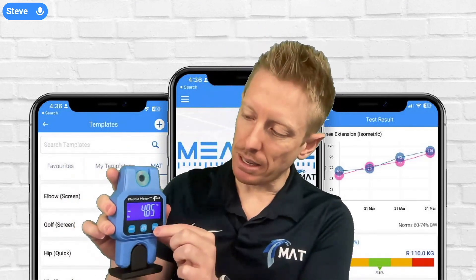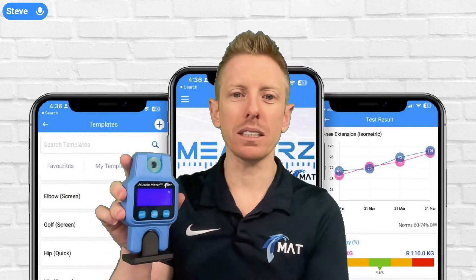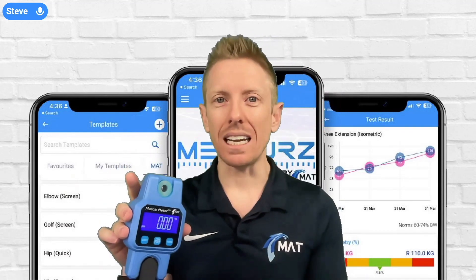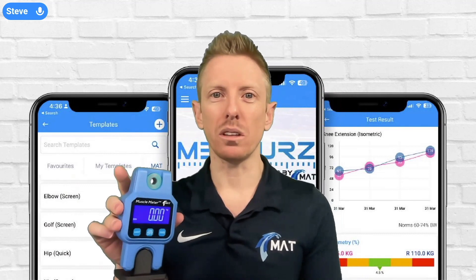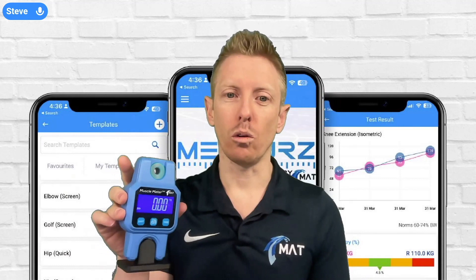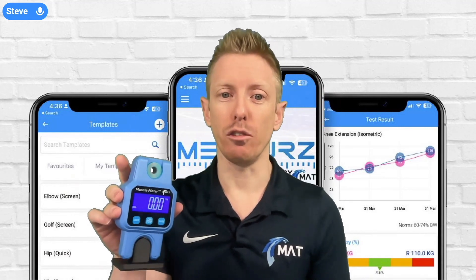Next to the on/off button on one side you've got the tare button. That's the button to reset it to make sure you get accurate, reliable data, and also to reset it between each test when you use it with the measures app, to be able to get that peak force for each side or each different test that you're performing.